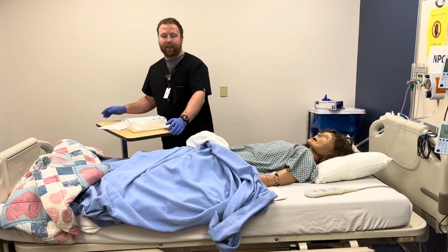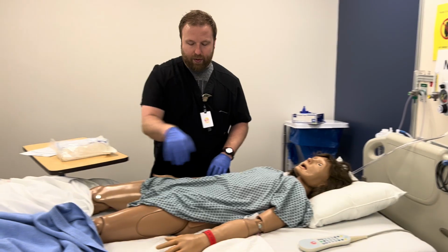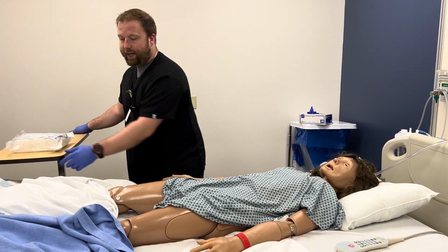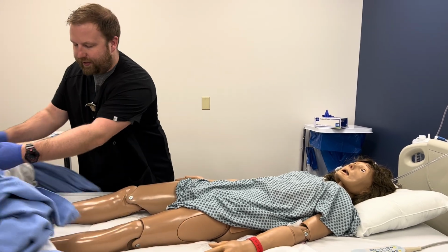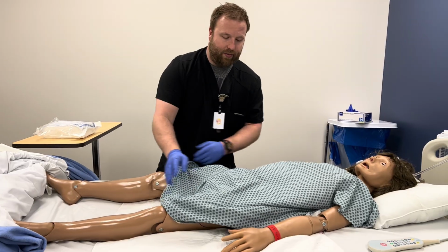At this time, we would drape the patient with a bath blanket and position appropriately. We want to make sure that we're laying flat. I don't have a bath blanket with me, but I would put that on top here, making sure that I can keep my legs spread apart as needed. Making sure that we're covered.